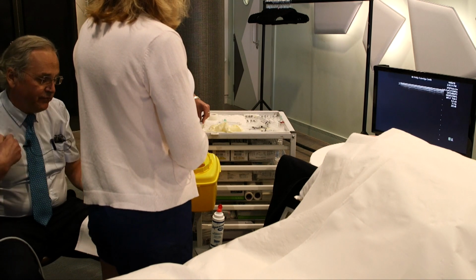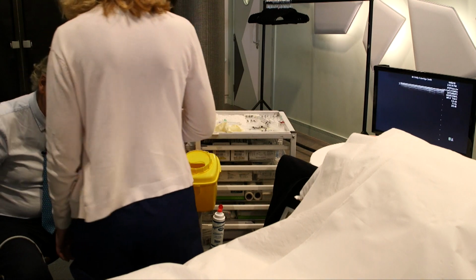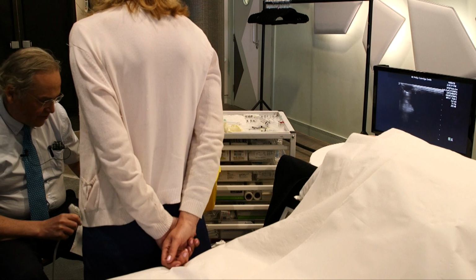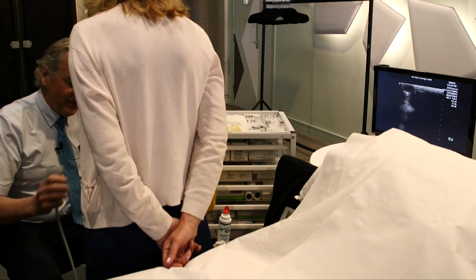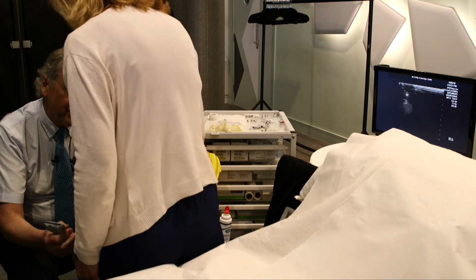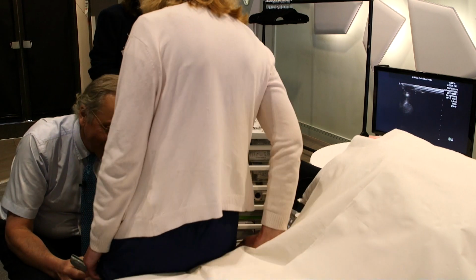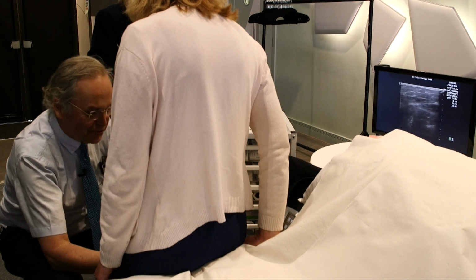And then if you look around towards me, what we also thought is that there is a problem with the saphenous vein at the front. If you lift this up a fraction, and just bend this knee and turn it out a bit. Just be careful of that. Couch is very feeble.